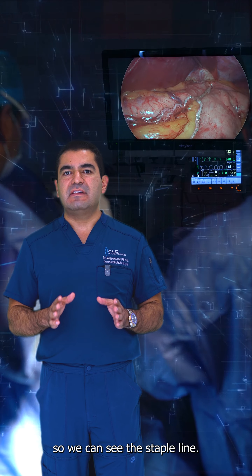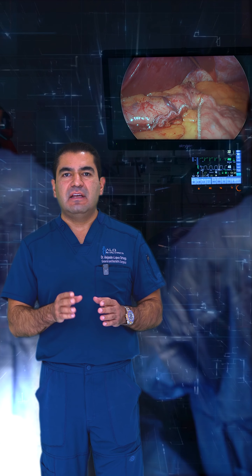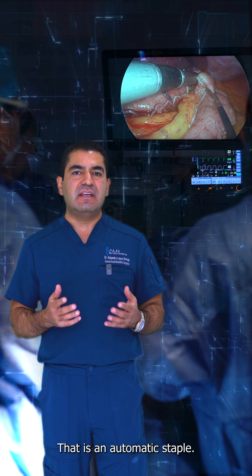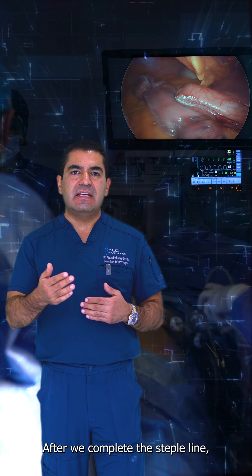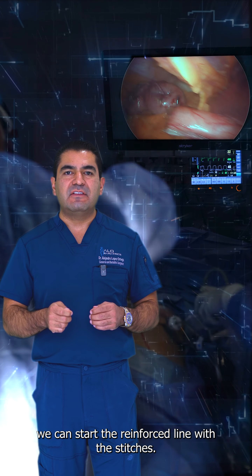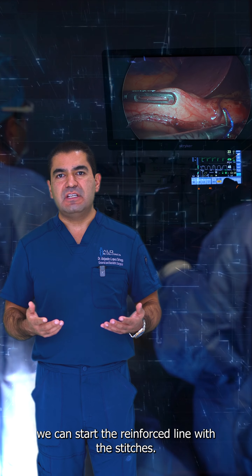So we can see the staple line, which is an automatic staple. After we complete the staple line, we can start the reinforced line with the stitches.